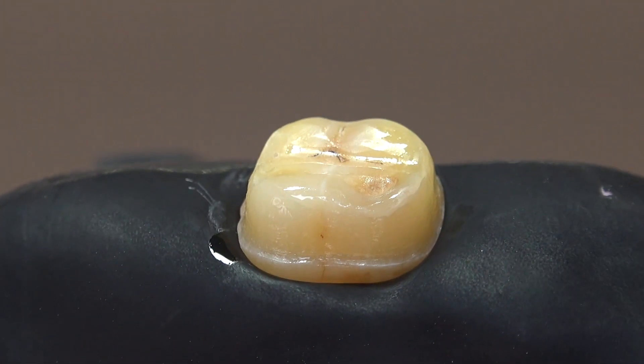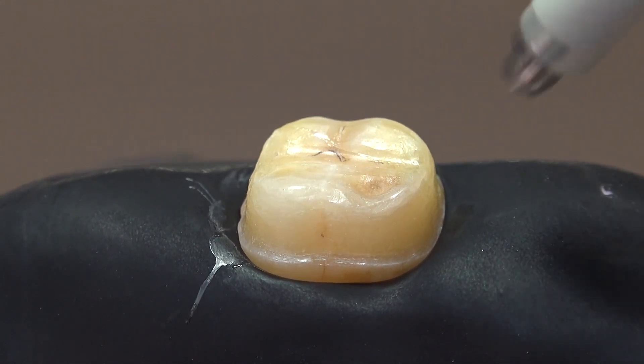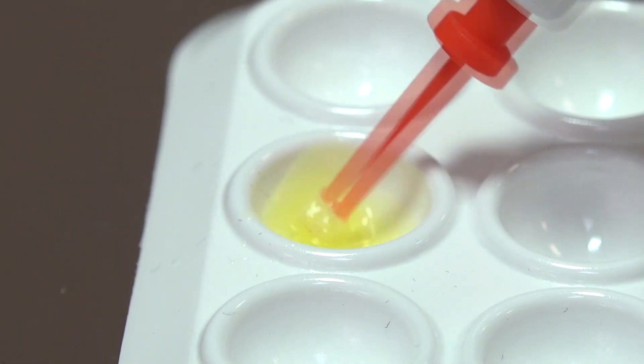Then the solvent is dried with an air spray. It is important that we air spray until the waving is finished. Now our self-etch primer has fixed the smear layer on the dentin surface and formed a thin hybrid layer.